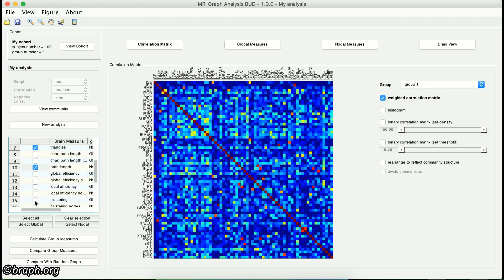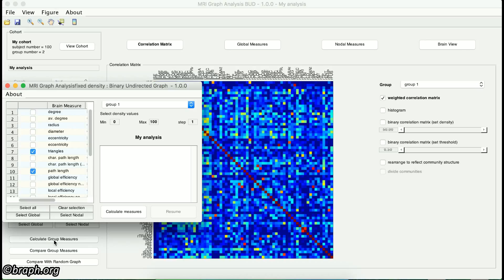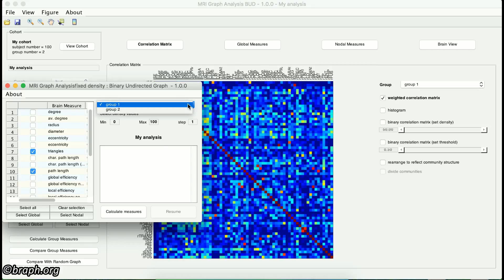To start calculating the group measures, click on the Calculate Group Measures button. As you see, the measures that were selected in the main interface are also selected here. You can modify your selection of measures for calculation as described before. On the right panel, you can define the parameters of the calculation. From this drop-down list, you can select the group of subjects for which you want the measures to be calculated. Below this list, you can define the minimum and maximum density and the step size.